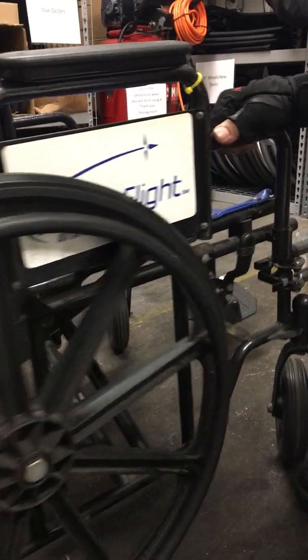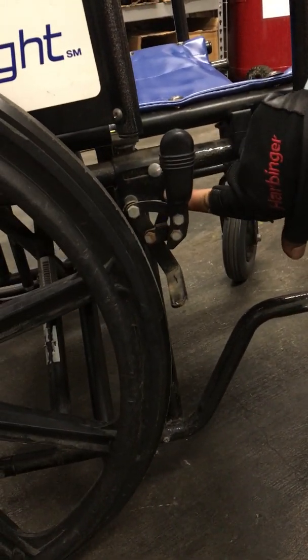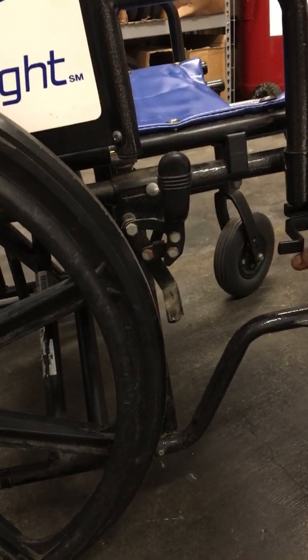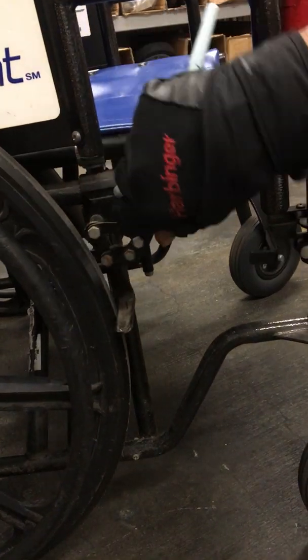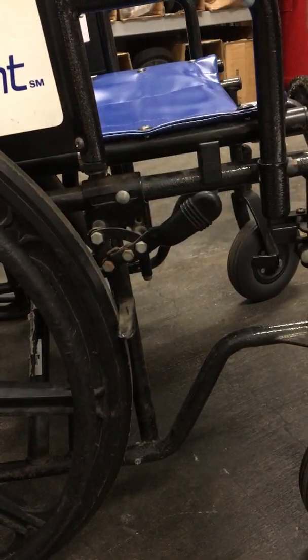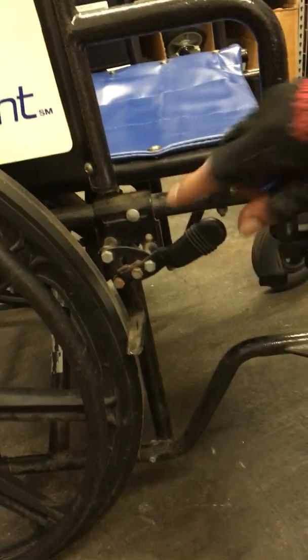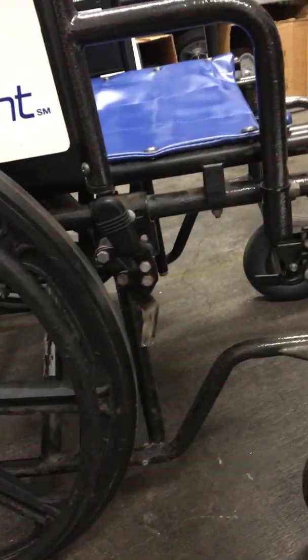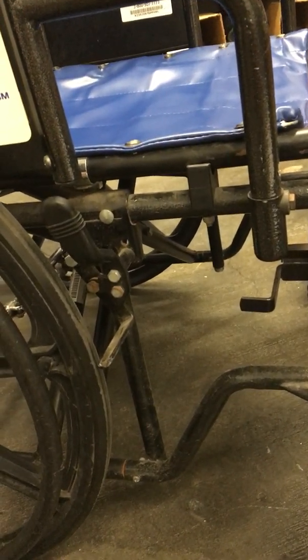Next, the brakes. If you notice, the brakes are already starting to rust in this wheelchair, and they're actually very easy to fall apart. A lot of wear and tear happening here, and there are times bolts and nuts need to be changed to something much stronger. So it would take about 30 to 40 minutes, because there's a lot of movement right over here, and it could be too tight or too loose, or else they'll just fall apart or be worn out easily again.